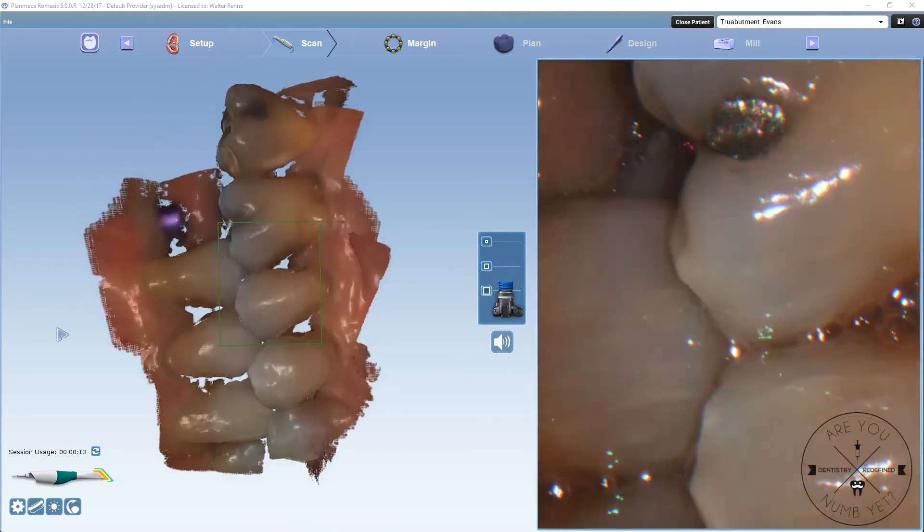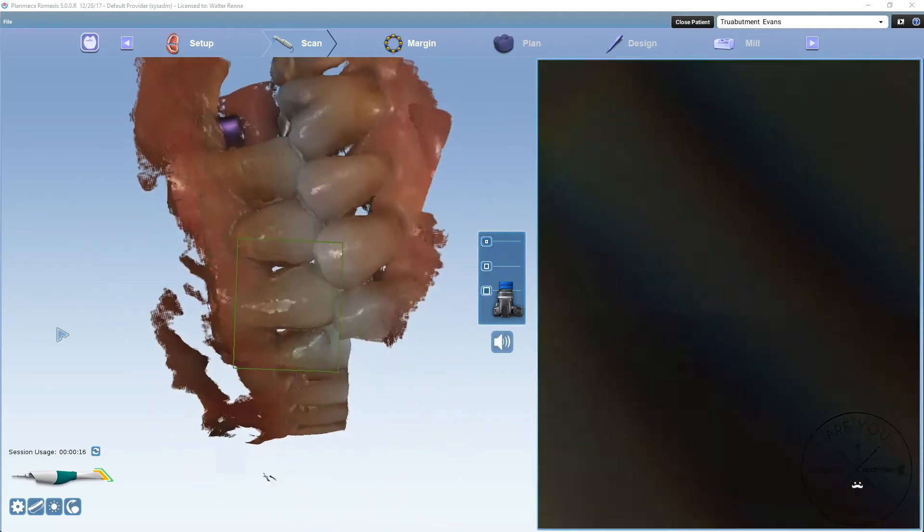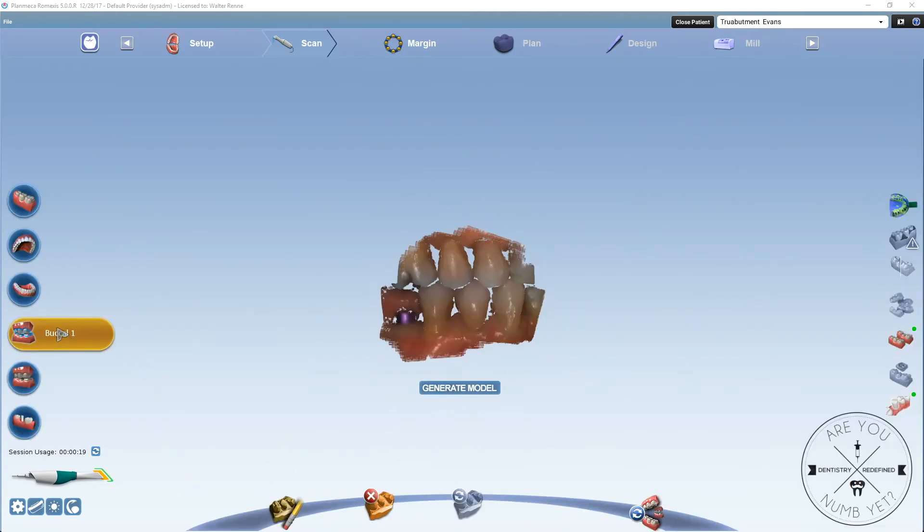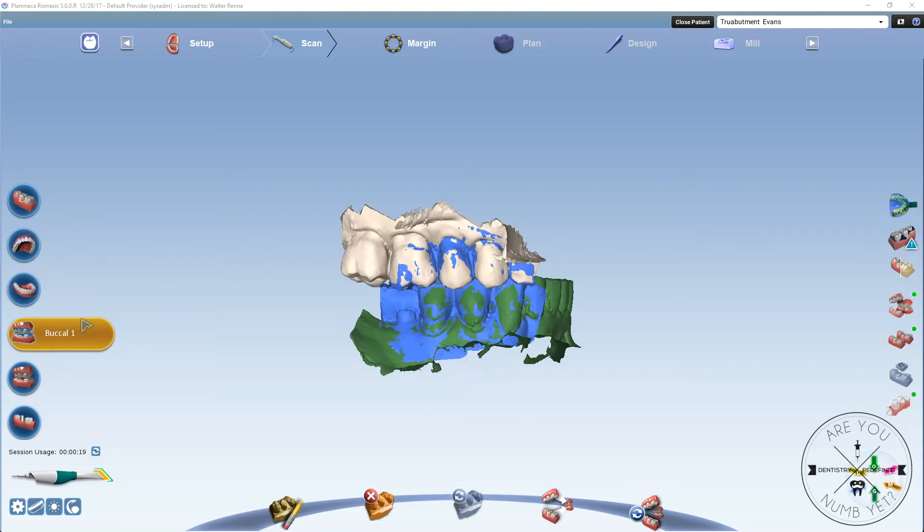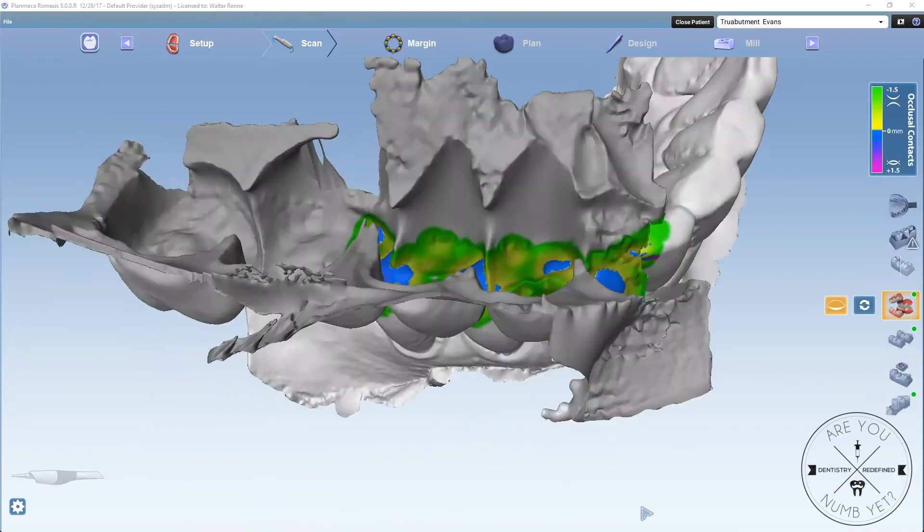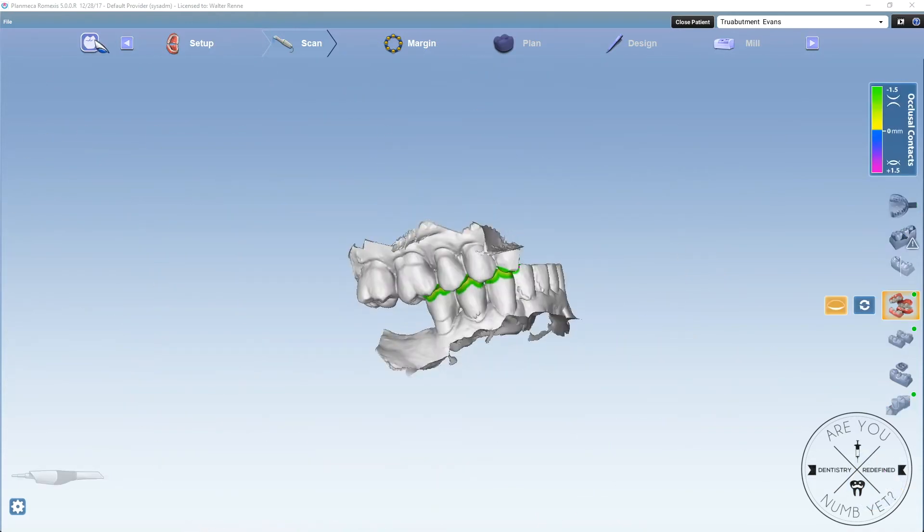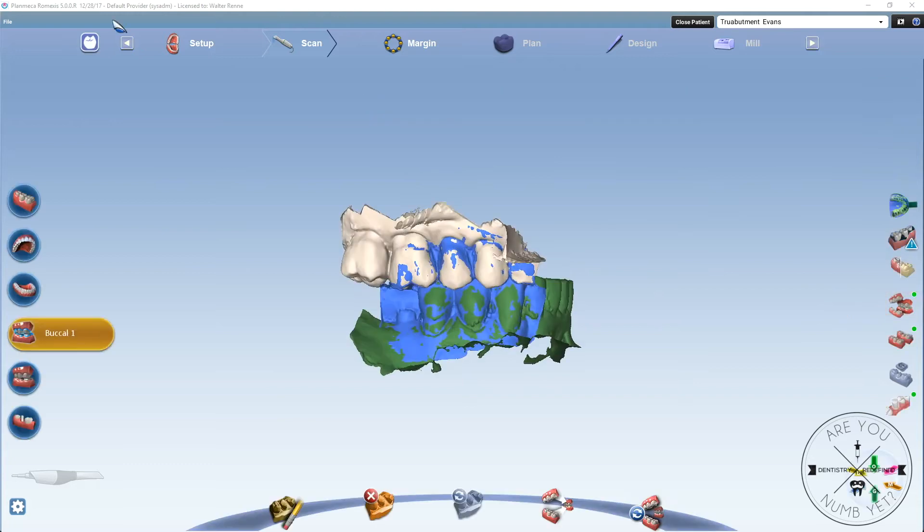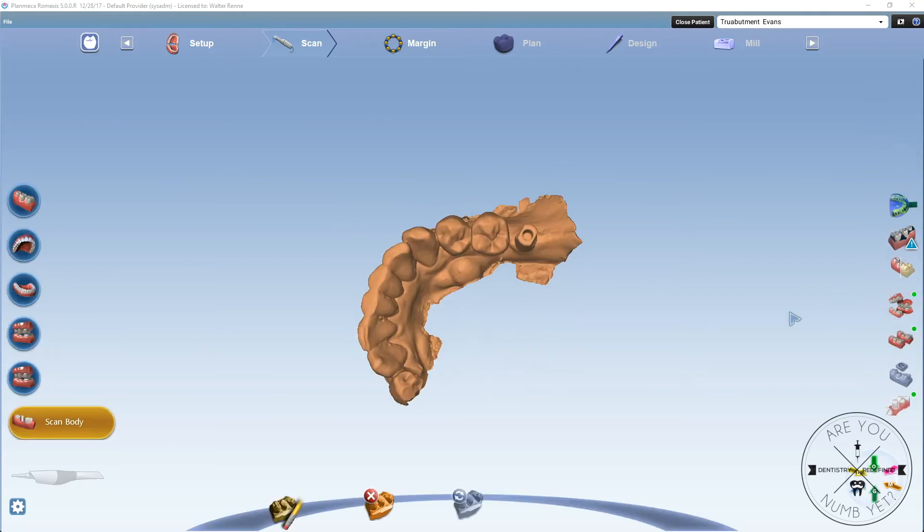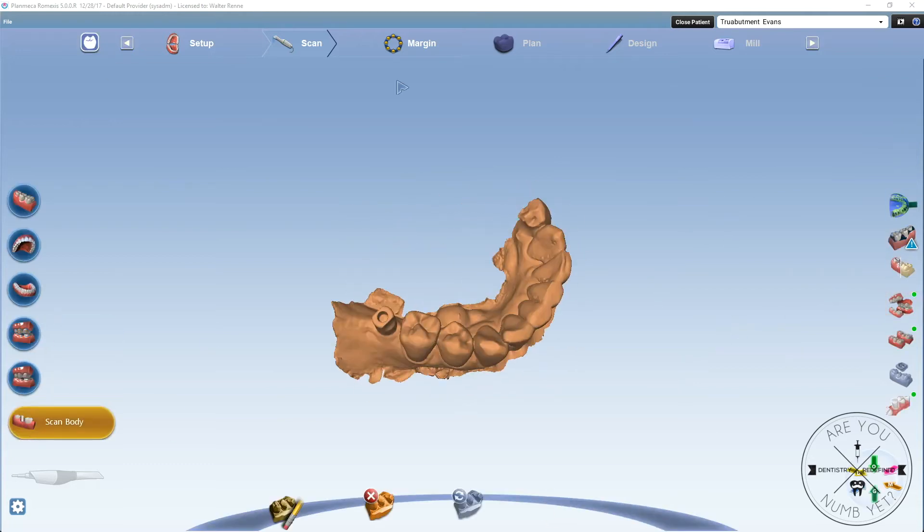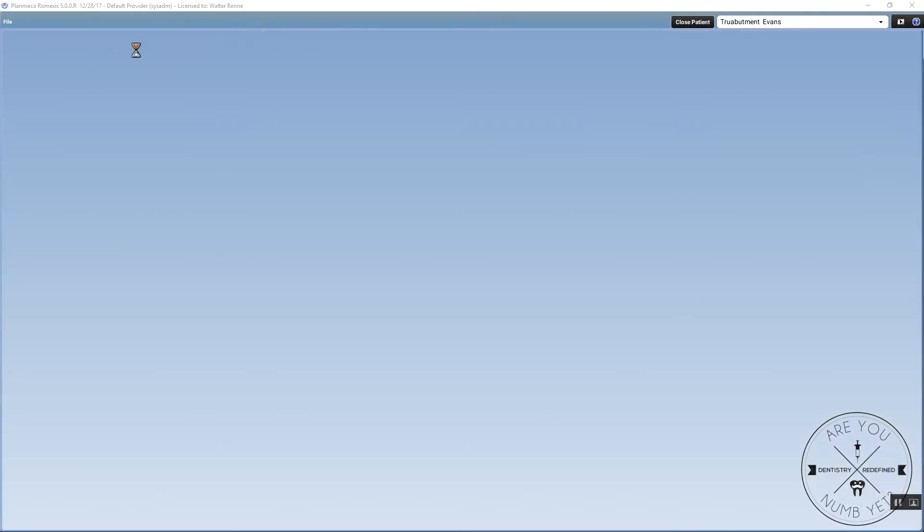Once you have the opposing scan, you're going to get the maximum intercuspation. This is where you actually need to slow down your scanning. The slower you scan the bite, the faster it'll automatically articulate. Triple check your occlusion. Make sure that you have a good occlusion for the lab, that everything's working correctly.